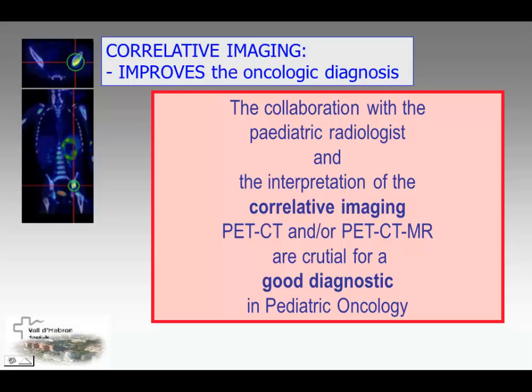In Still's disease or chronic juvenile arthritis, they ask for a bone scan, and then we perform a blood pool image of the whole body and bone images also of the whole body. If you can use fluorine, it's much better because the quality of the image is much better than that of the bone scan.